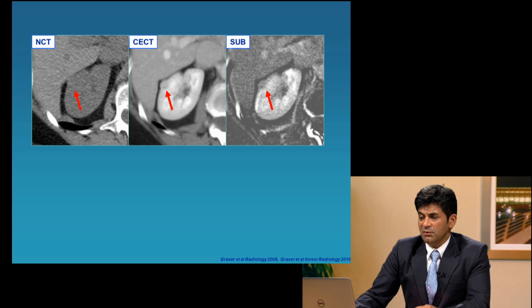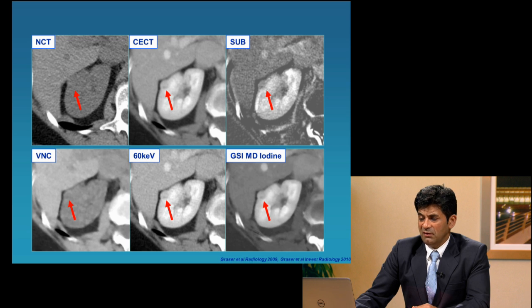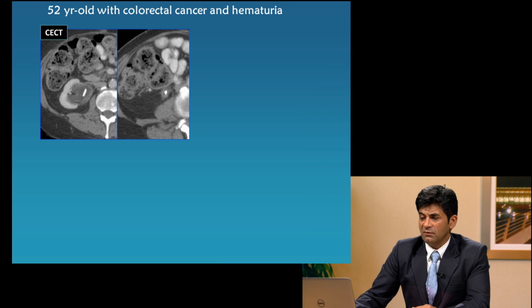And more examples of lesions, a small lesion less than a centimeter in the kidney, we detect. Characterization is a challenge. I'm showing you the single energy images, and there are comparable dual energy images, and just looking at the material density iodine image, one can be confident about distribution of iodine in the lesion that is essential for making a diagnosis of a solid lesion.